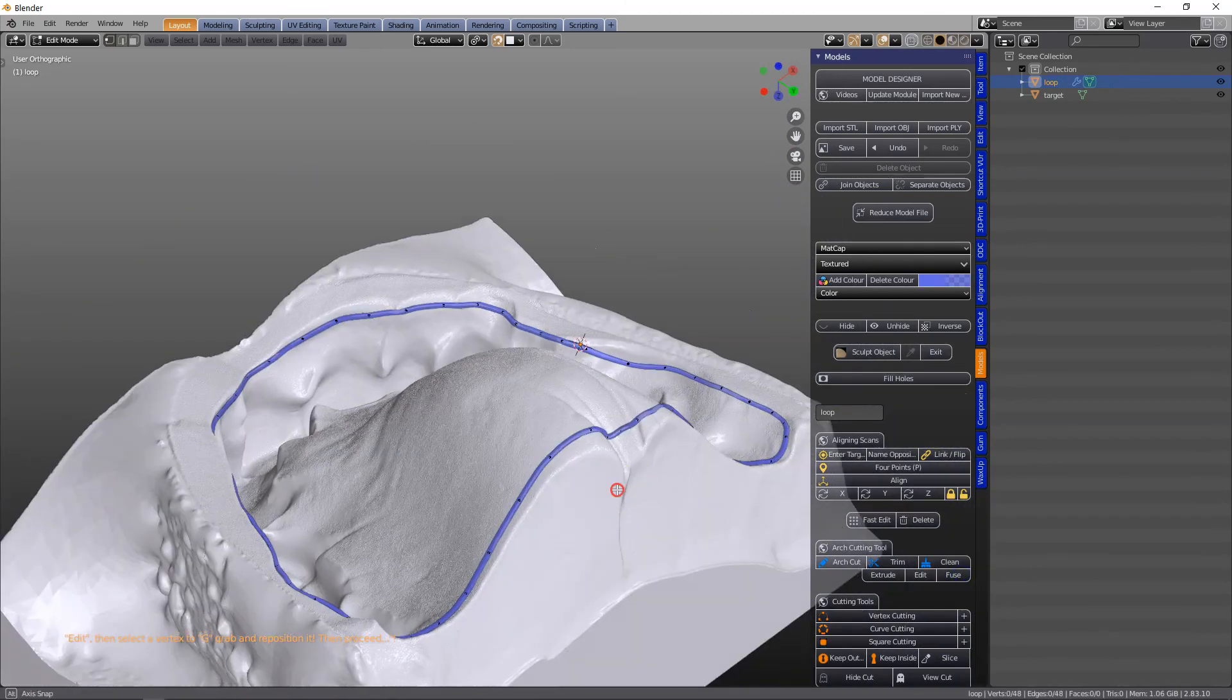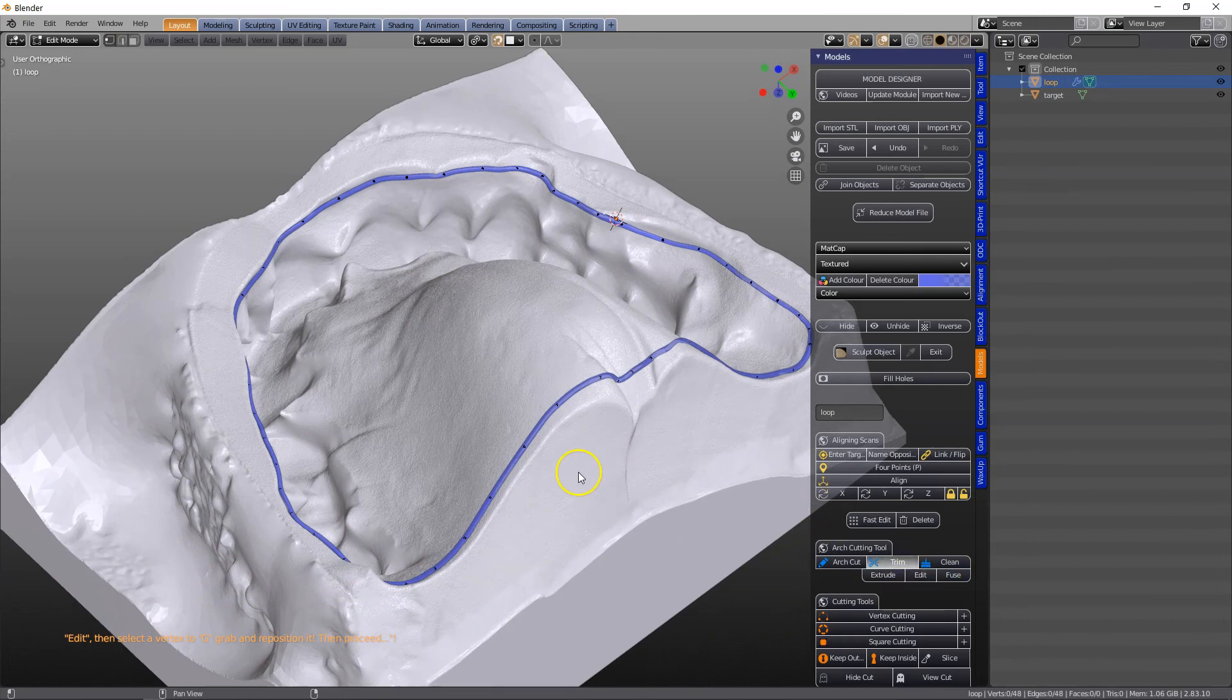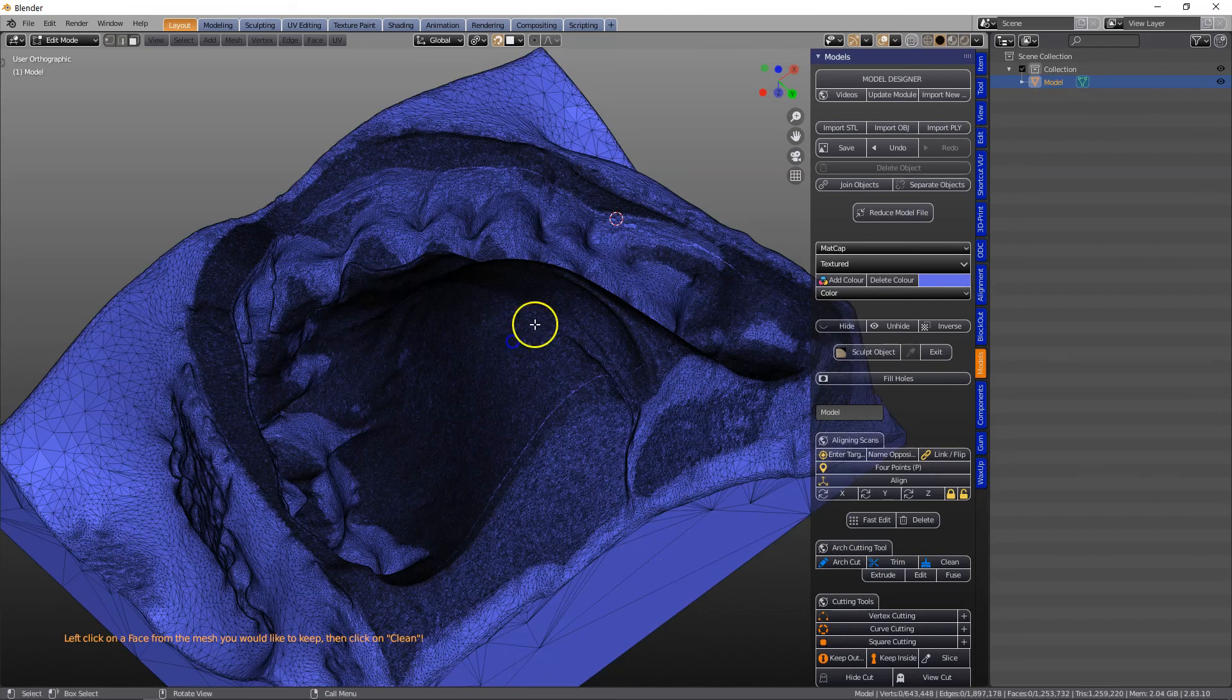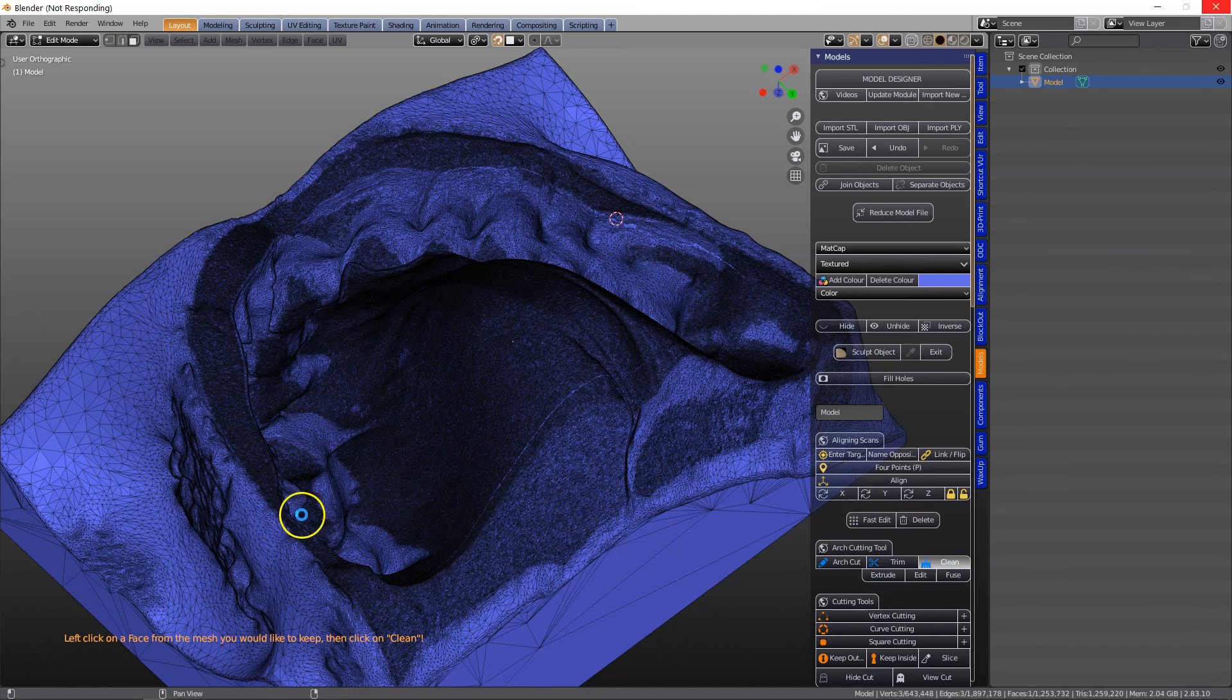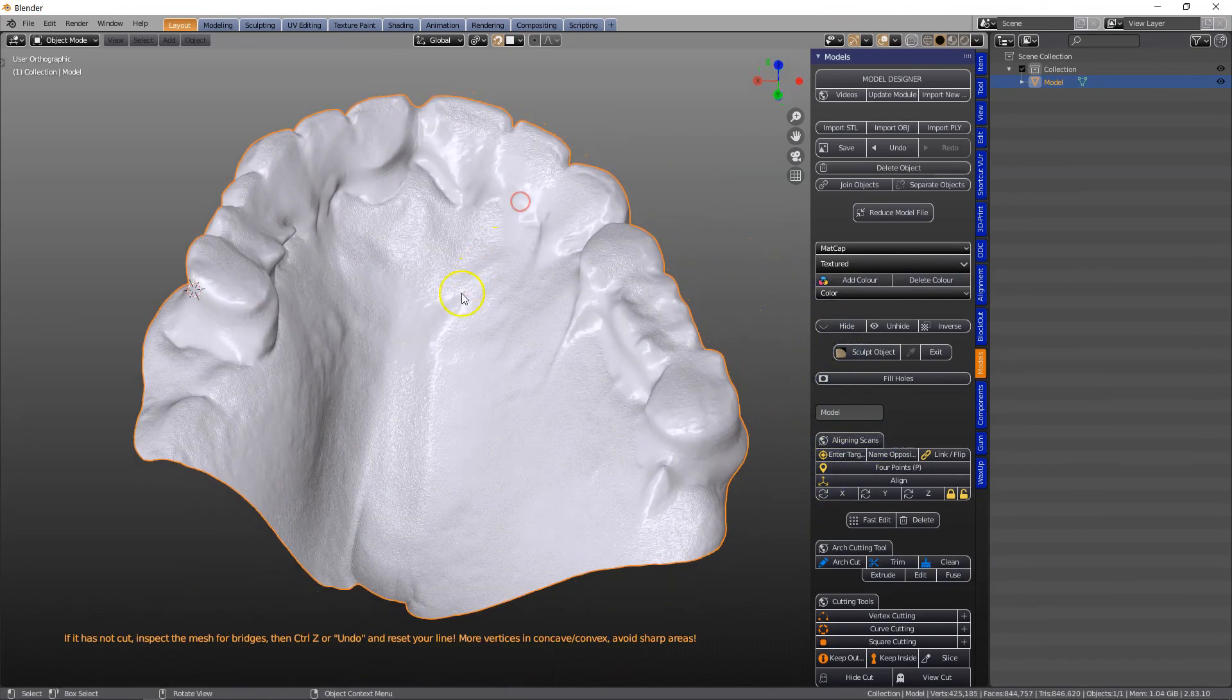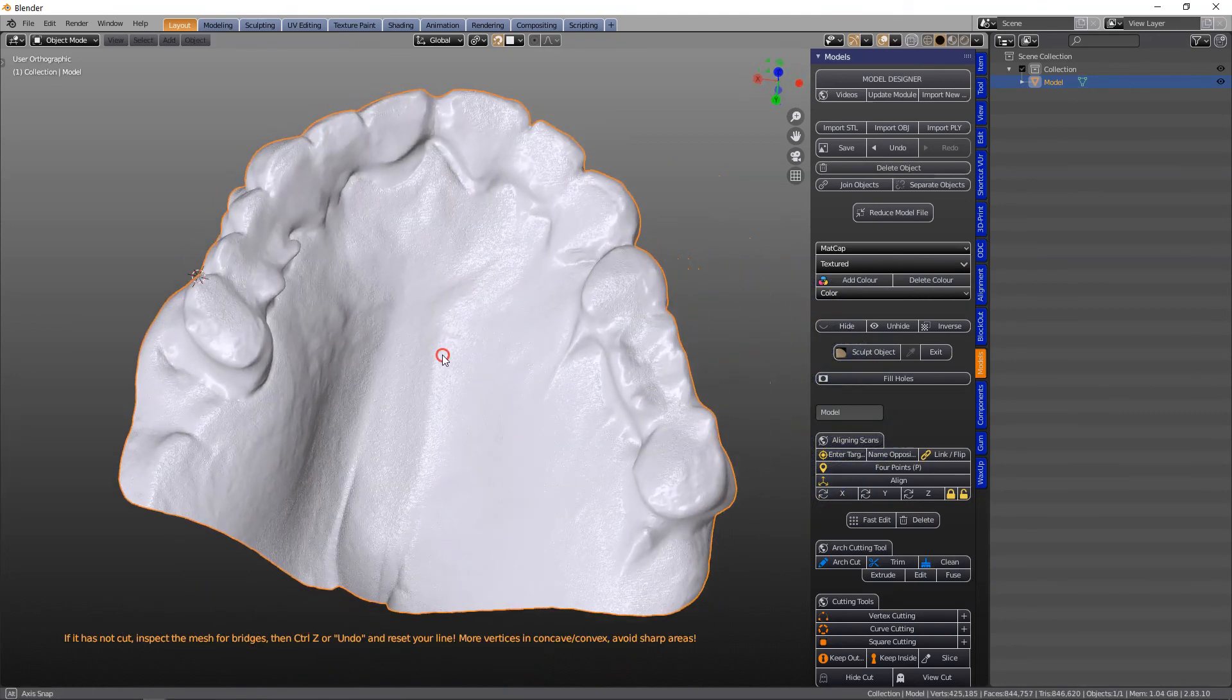Fuse it, click on Trim, select the mesh we'd like to keep, and clean. All right, so here we've got our scan basically.